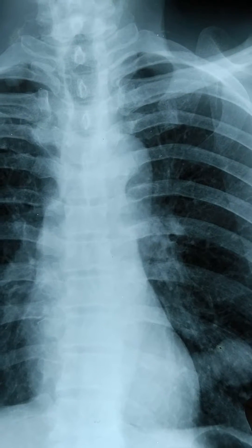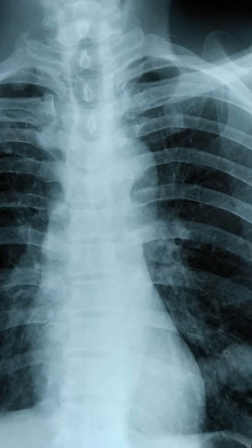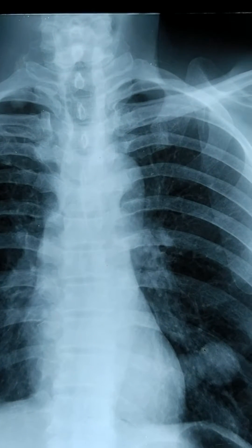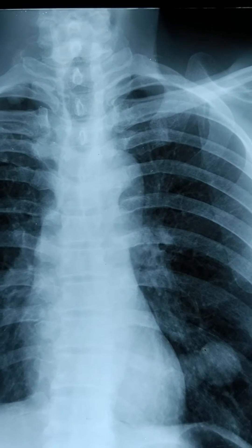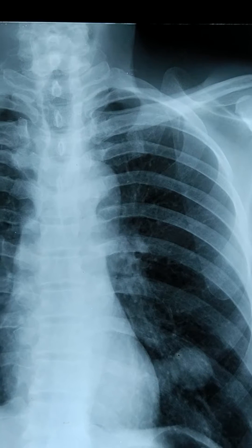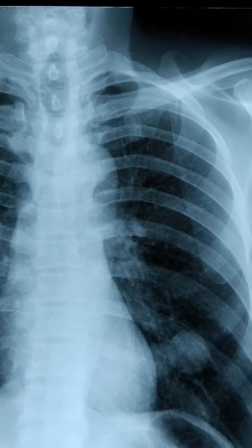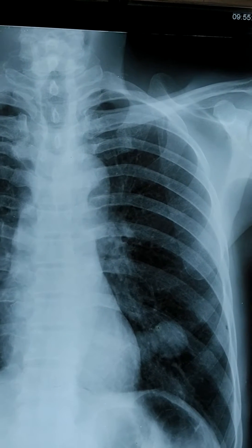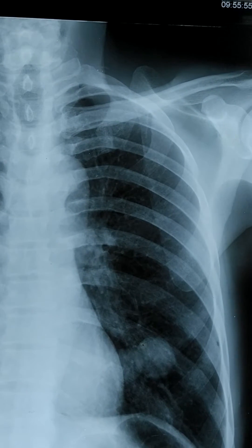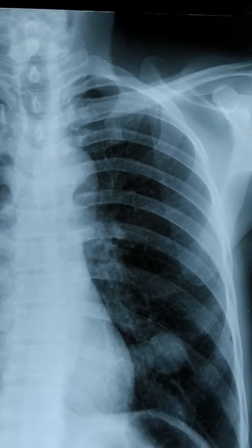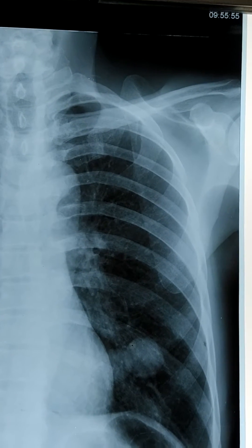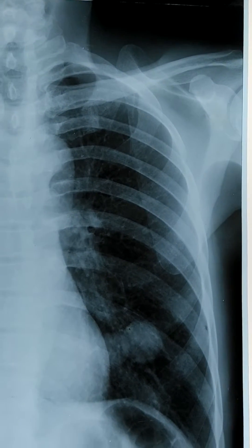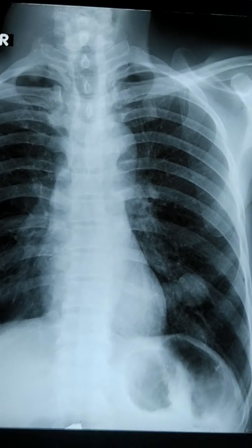For further evaluation, we should go for a CT scan of the chest, and then CT-guided biopsy. Thank you.